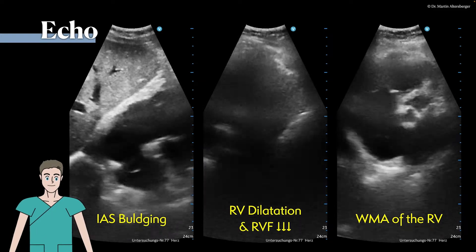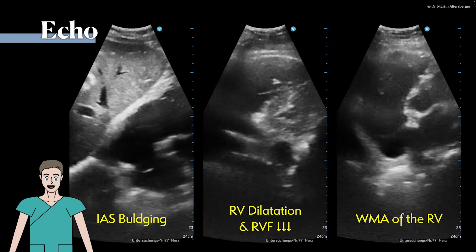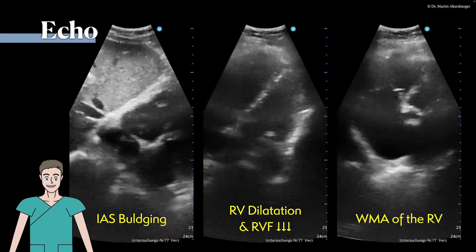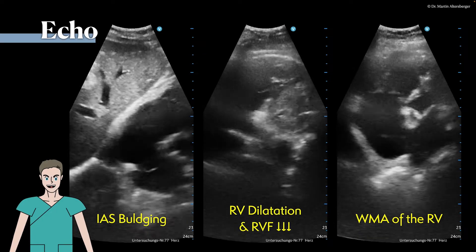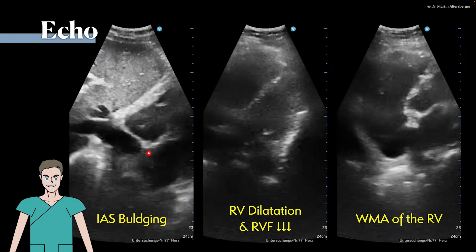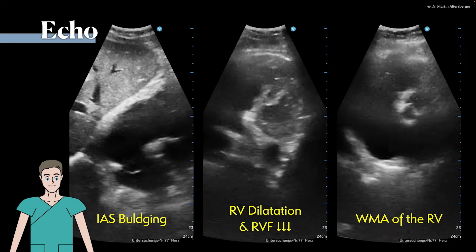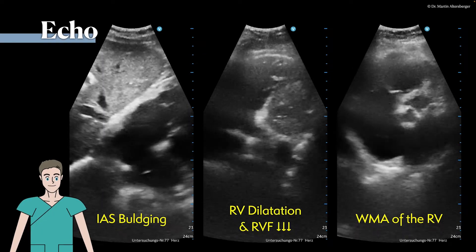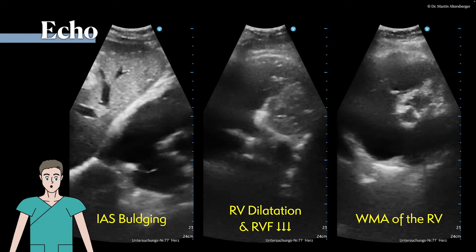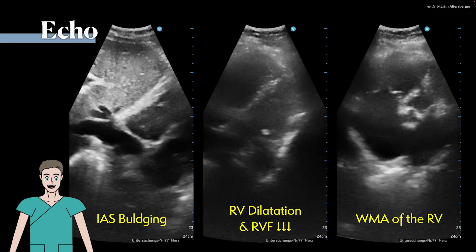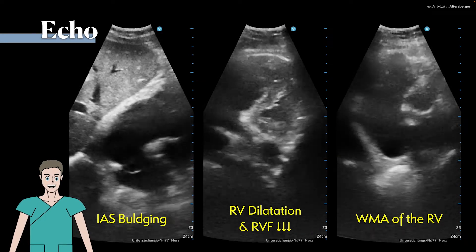We have right ventricular dilatation and a reduction in right ventricular function, and the interatrial septal bulging from right to left tells us that right ventricular pressures or volume are mainly the problem in this case.